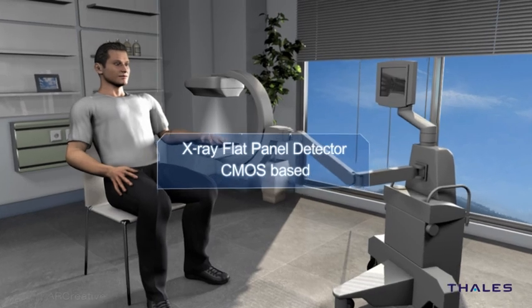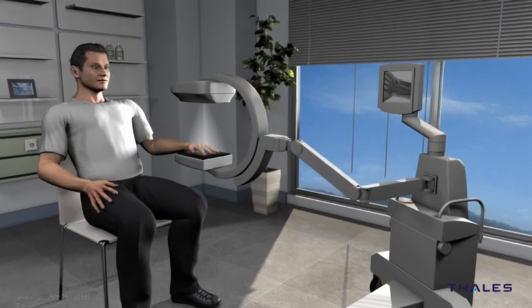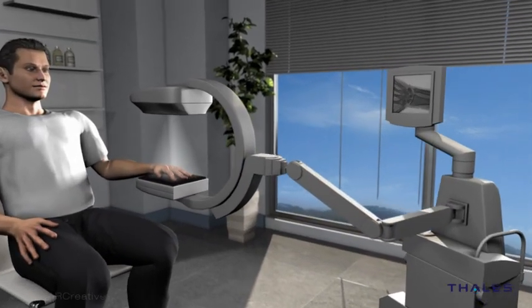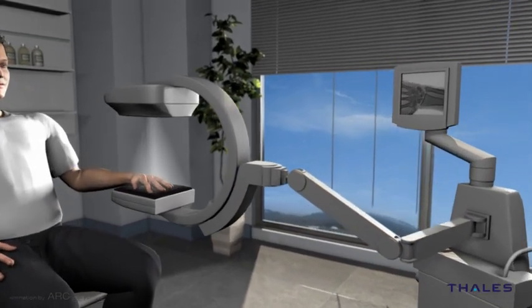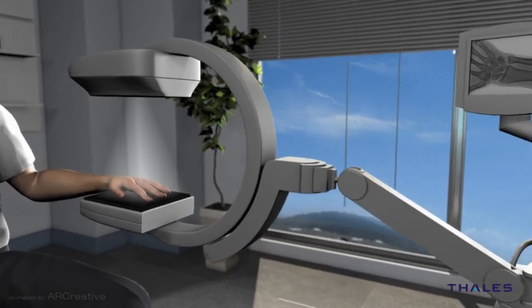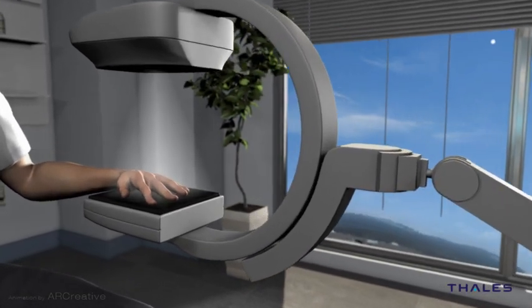In recent years, the medical and industrial imaging markets have shown an increasing interest in CMOS-based X-ray flat panel detectors.